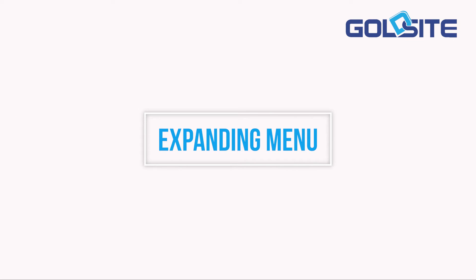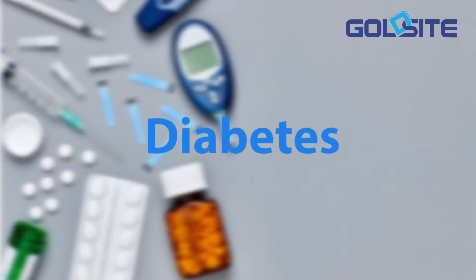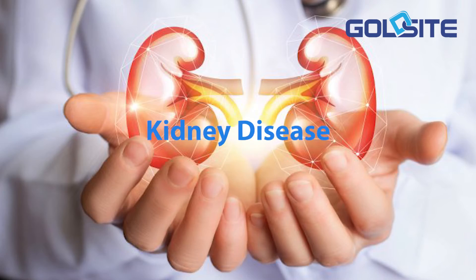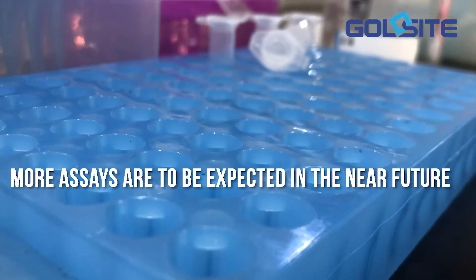Diverse assay menu available. Our expanding test menu covers a range of categories — from hepatology, diabetes, blood lipid, to kidney disease. More assays are to be expected in the near future.